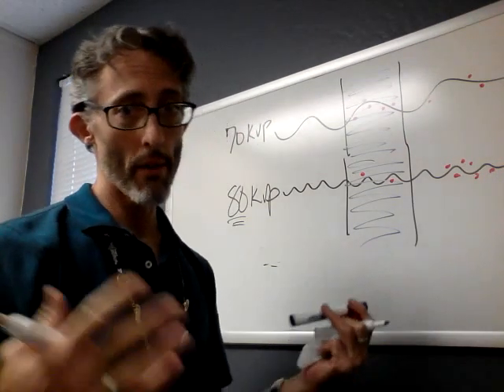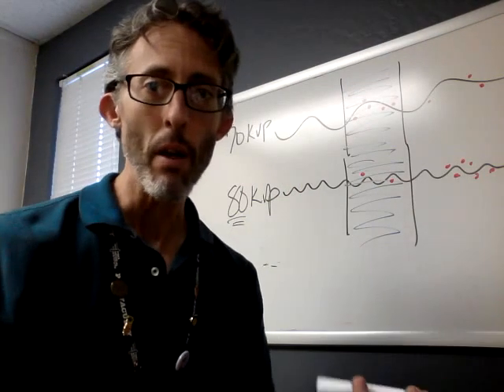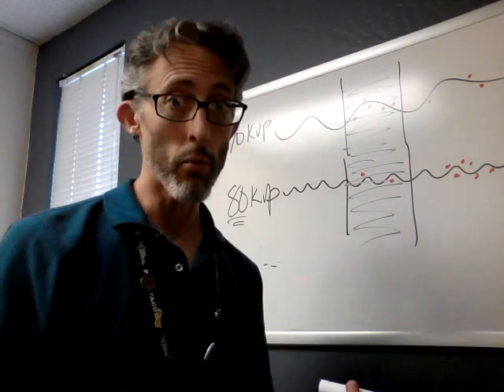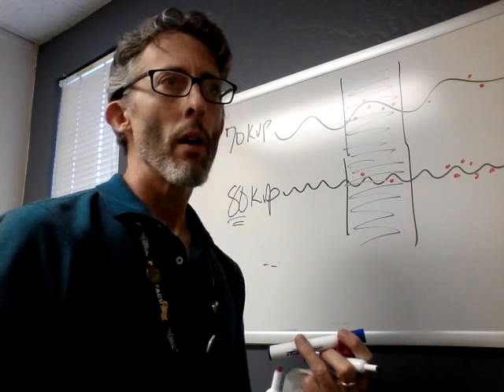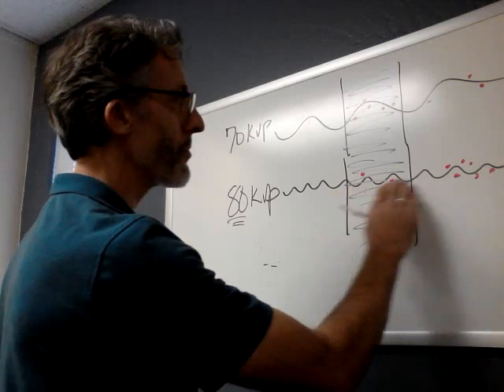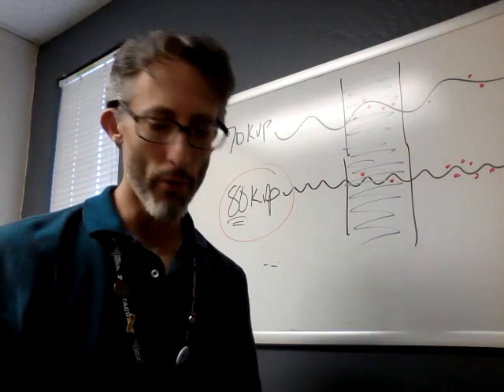So we could have solved it by, of course, doubling our mAs from 20 to 40 and basically used the same energy of a beam to put more photons through the patient, and that would have resulted in more photons hitting the image receptor, but the patient would have received those photons as well. So what we can do by increasing the kVp, it's kind of like you're making better use of the photons you already have. Instead of increasing the number of photons, you are using them in a more efficient way. You're sending more of them through the patient all the way to the IR. And you're getting a great image by increasing your kVp by 15% rather than doubling the number of photons.